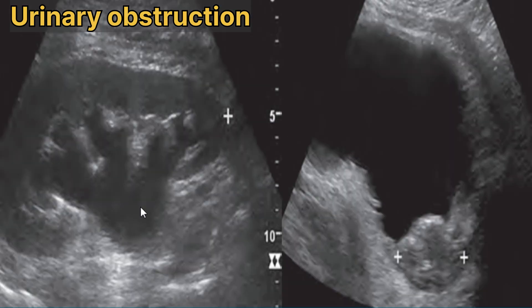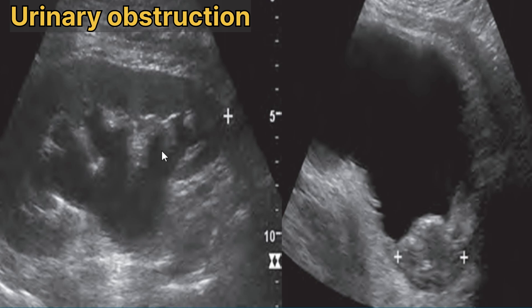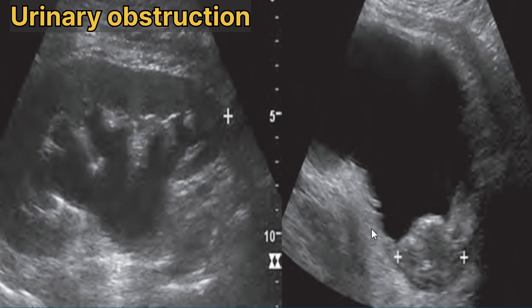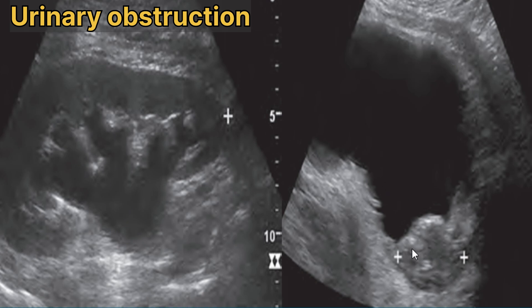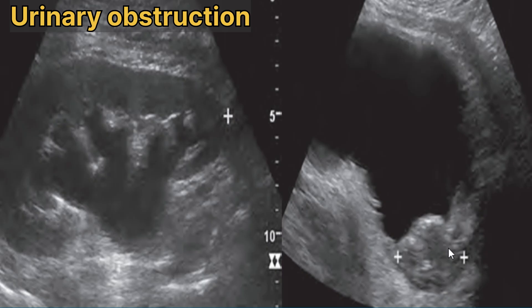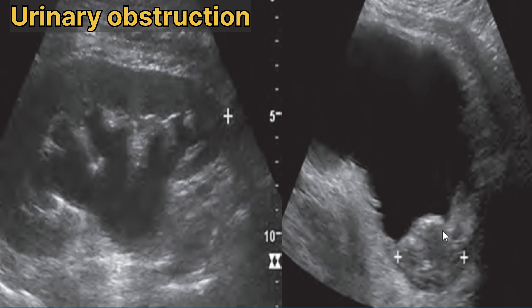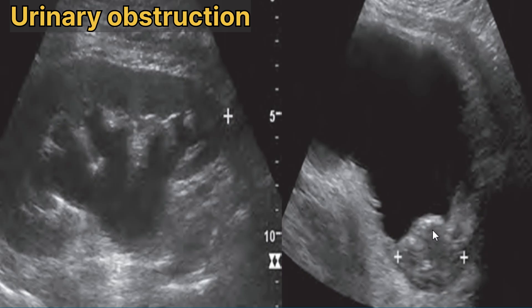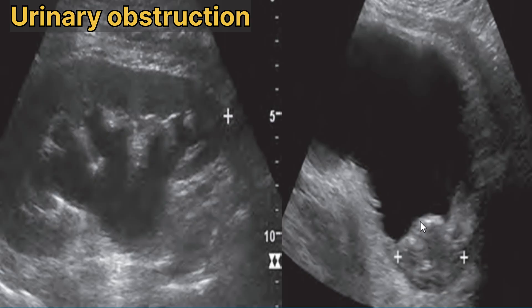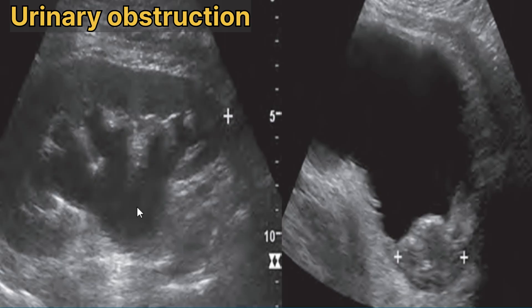In this sonogram we can see obstruction causing hydronephrosis in the kidney. This obstruction is due to bladder cancer. This is the longitudinal view of the bladder showing a mass at the bladder base that is obstructing the vesicoureteric junction, causing hydronephrosis in this kidney.